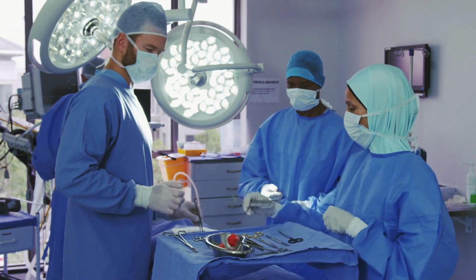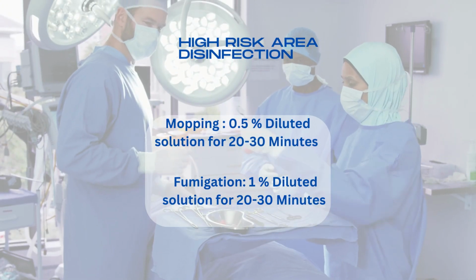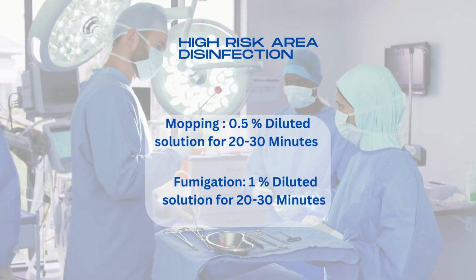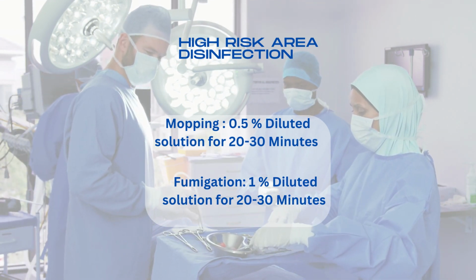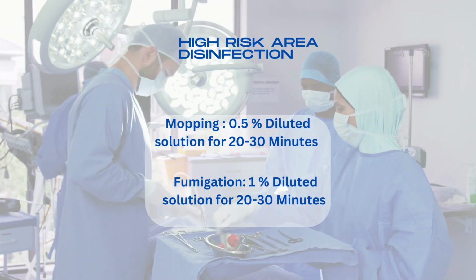0.5% diluted solution is prepared and is used for mopping of the surfaces of the high-risk area. Same solution can also be used for spraying on the surface. The contact time of 20 to 30 minutes is allowed for disinfectant to act properly. 1% solution is used for fumigation of high-risk areas for environmental disinfection.